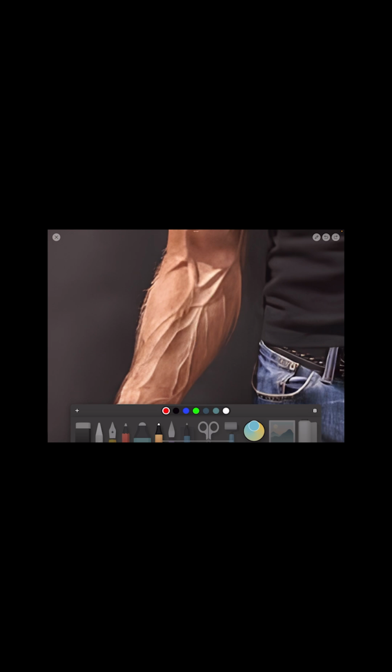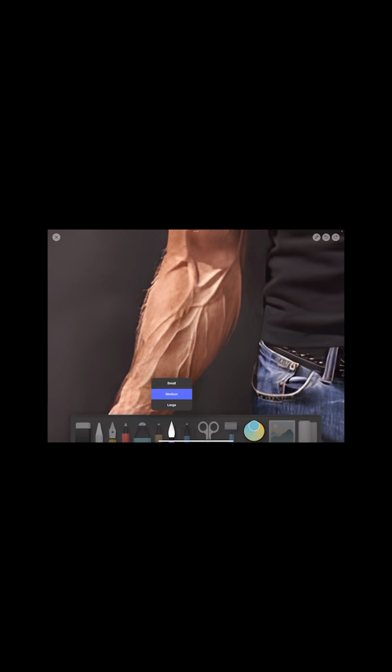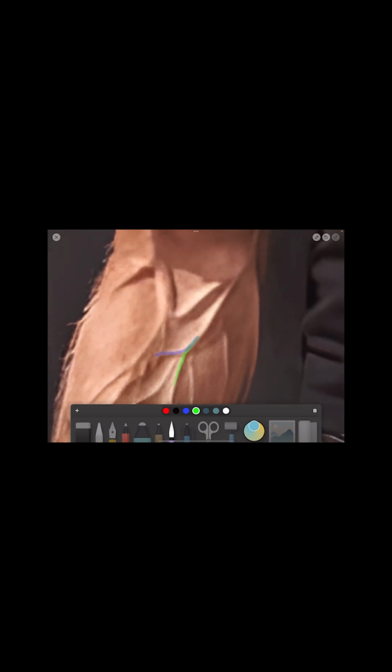junction. And the reason why that's so important is we are trying to allow the flow from the blood, from the collateral branch, to dilute the medication. So by the time it gets up to this junction right here, it'll be diluted by the blood. And it looks like there's actually another junction joining right here like that. And so you'll have less of an irritative effect because the blood has diluted this medication.